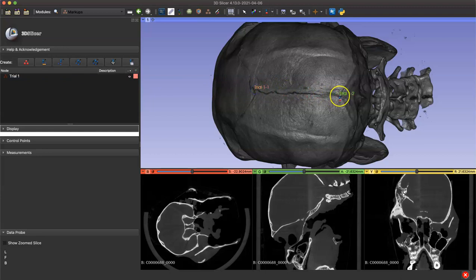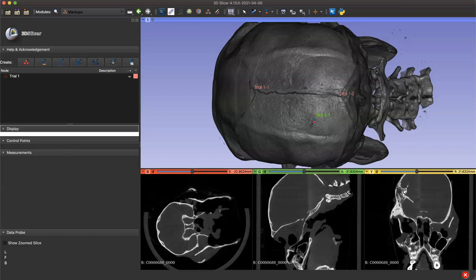I'm going to roughly place a landmark at bregma and lambda. Remember you can adjust these points after you place them, but notice how the color has changed from green to pink once the point has been placed.